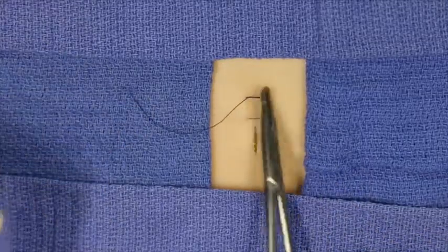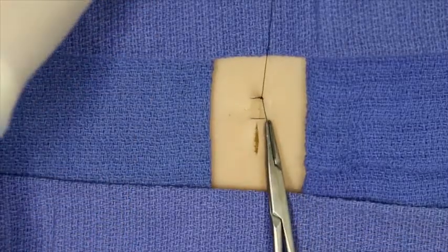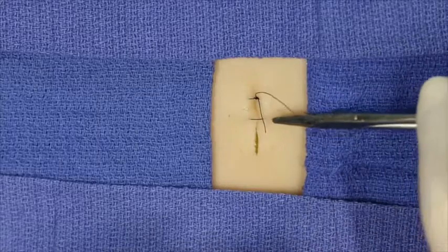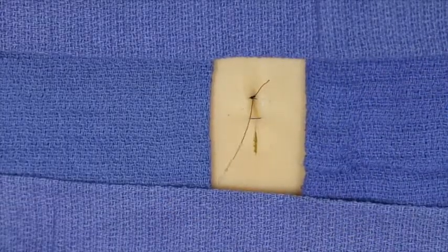The net effect of this approach, as you can see here, is that the wound edges are pulled inwards rather than outwards. Thus they are inverted rather than everted.